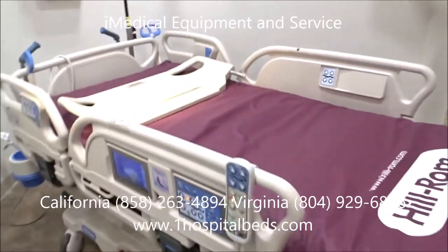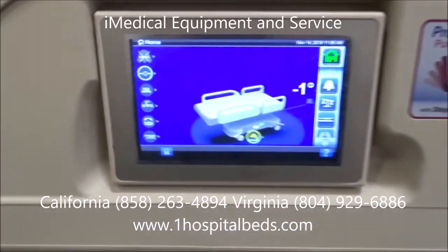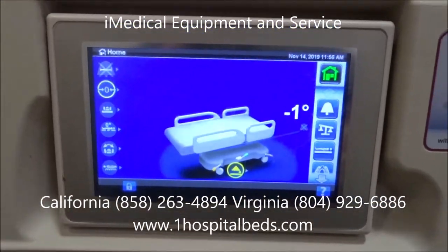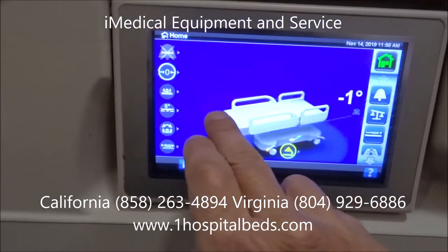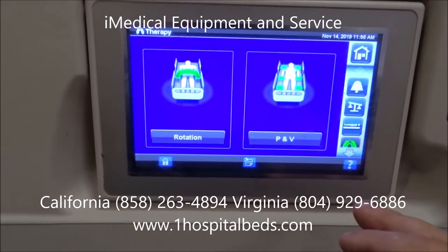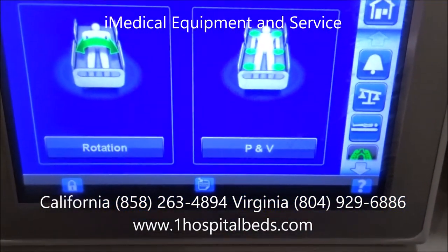The pulmonary feature — or percussion vibration — on this bed is accessed right off the control panel. We press down here to open it up, come down to where it says 'lungs,' and then go into where it says 'P and V.'